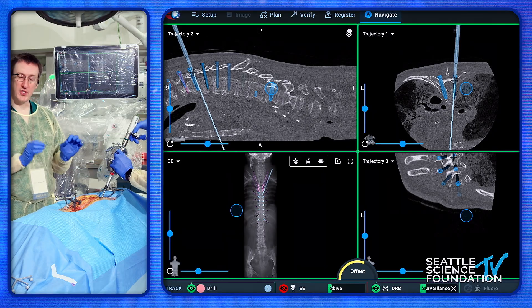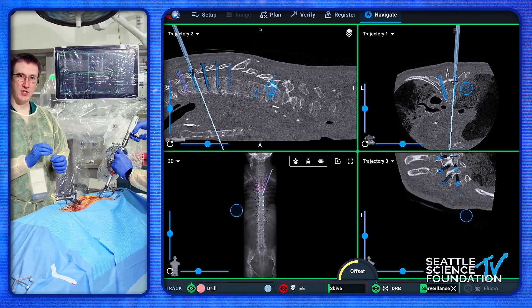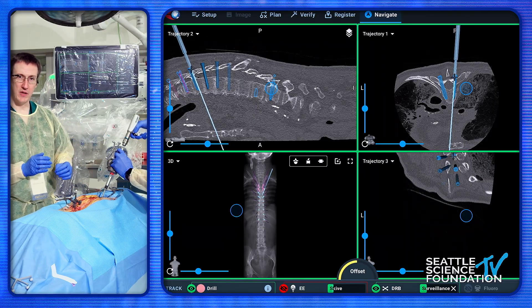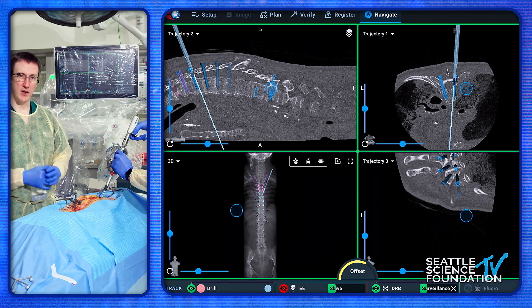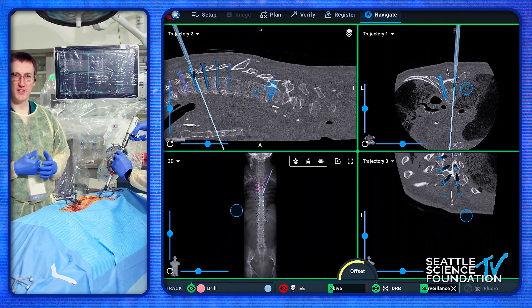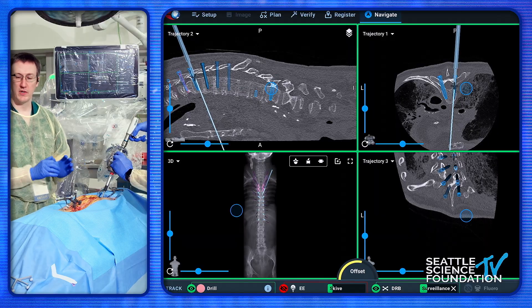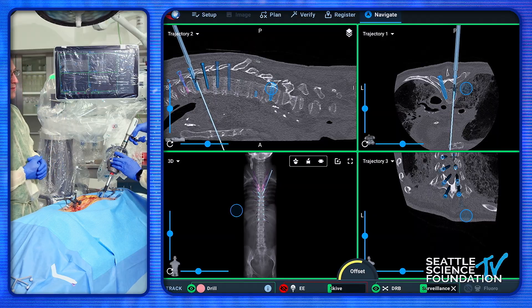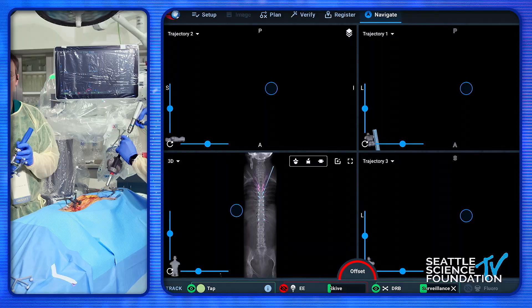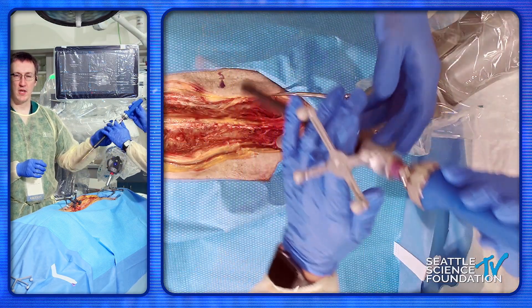Now we're just going to lightly touch — we're in the divot that the burr made — and just go full speed, letting the power take us down the pedicle. You really don't want to be shoving; just let the weight of the instrument go down. The gentleman that taught me this technique was named Dr. Guillo, so we always call it 'Guillo hands.' Once you get down, it'll show you where you are on the screen.